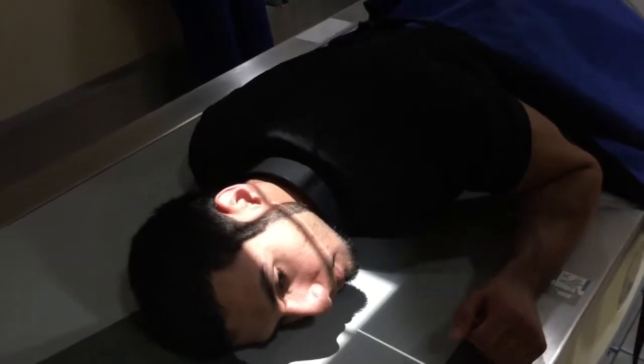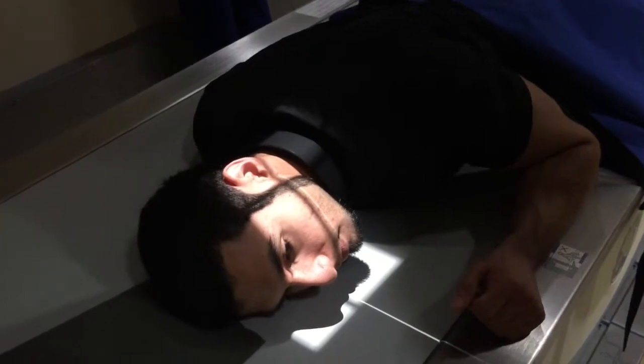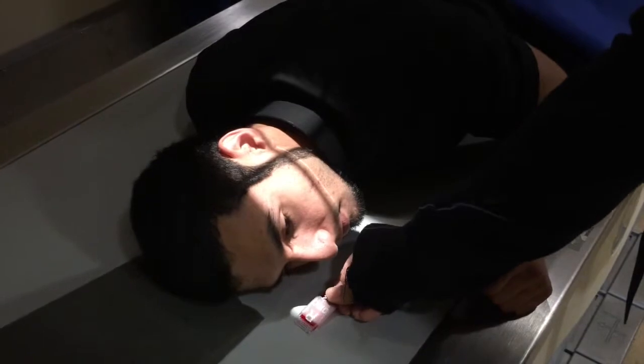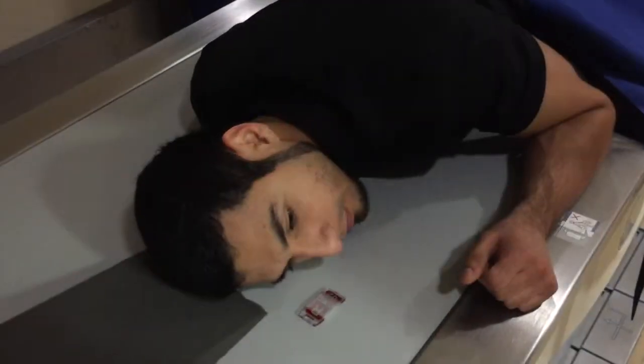And like I said, you want to make sure that the CR is at the zygoma, which is the protuberance of that cheek right there. And since you're faced on your right side, we're going to go ahead and put this right marker right there. All right, hold your breath.